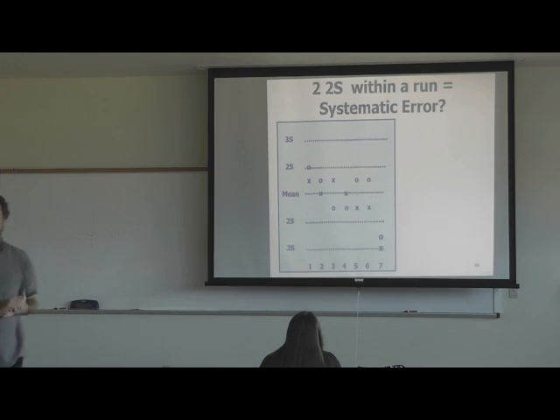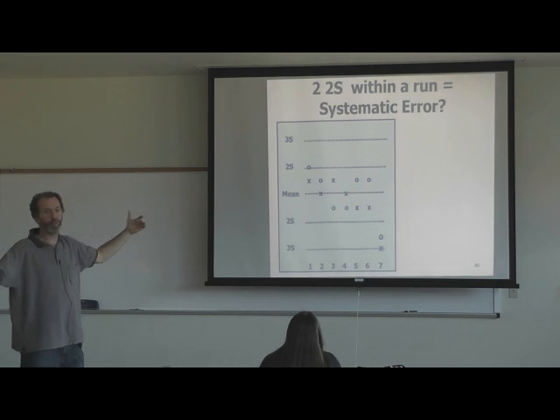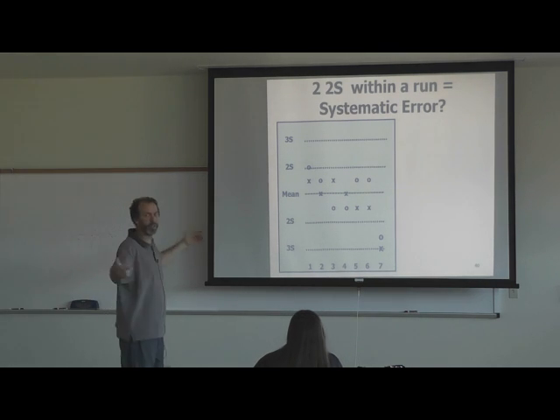So basically, anything within 3 standard deviations, then you have to consider it as an error? Anything greater than 3 standard deviations is going to be a 13S error that you have to stop. It's a rule violation, 13S.